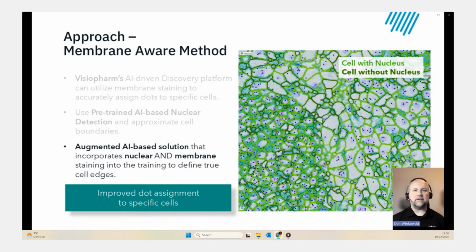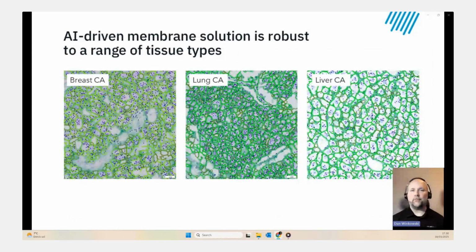What I will also add here is that with this staining pattern and these staining conditions, this algorithm can work across different tissue types, making it highly adaptable. And to that last point, you might be wondering whether the solution is custom to the specific project or whether it can generalize across tissues. And the answer to that is yes, it can generalize, primarily because the algorithm depends only on the hematoxylin and IHC membrane stain. Here, I'm showing the performance on a few different tissue types that we tested, and obviously we'll continue to optimize in the future in collaboration with the molecular instruments team to create a robust solution for this.